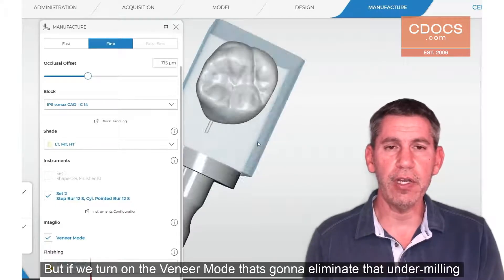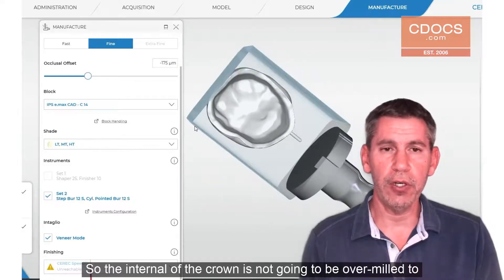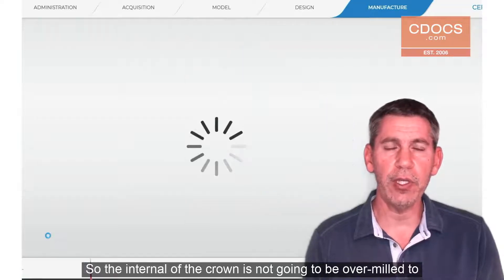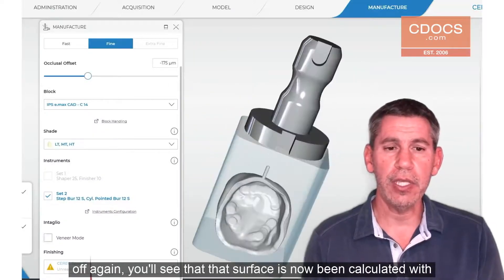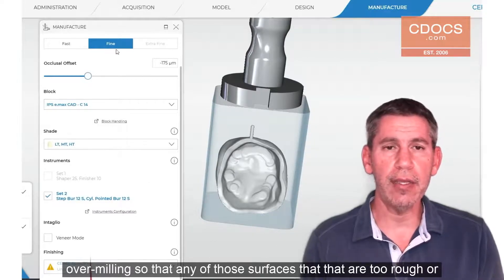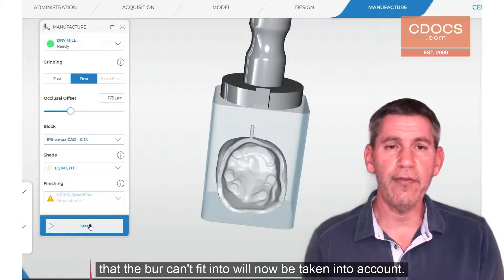If we turn on veneer mode, that's going to eliminate that under milling or over milling feature, so the internal of the crown is not going to be over milled to compensate for any sharp areas. When we turn veneer mode back off again, you'll see that that surface has now been calculated with over milling, so that any of those surfaces that are too rough or that the burr can't fit into will now be taken into account.